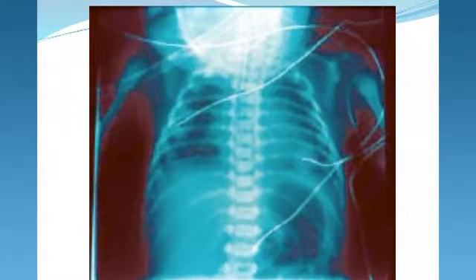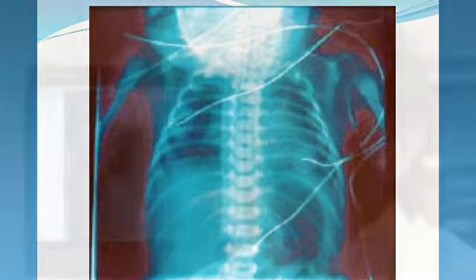And again, we go back to the baby with pulmonary hypoplasia. If you say, well, gee, this baby's right now about 8 ribs, and that's underinflated for most people because we use 9 to 9.5 ribs. So you must look at the lung disease. Look at these lungs. These lungs are clear. What that means is the lungs are small. So if you push this to get to 9 ribs, you would probably create an air leak and injure the lung because they're small and fragile.